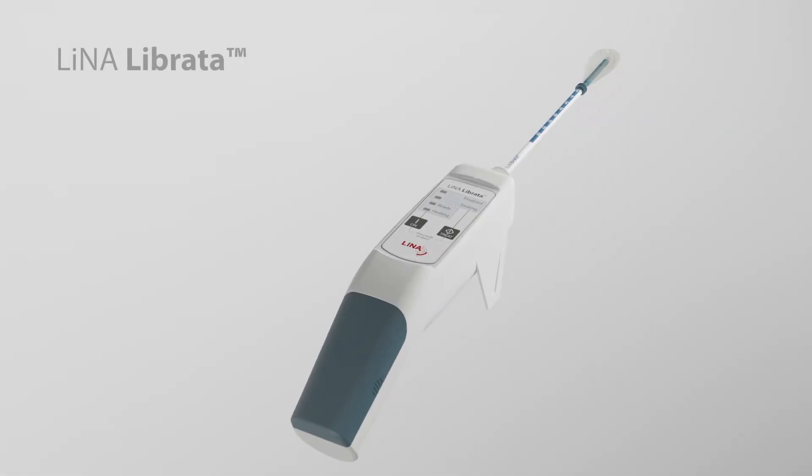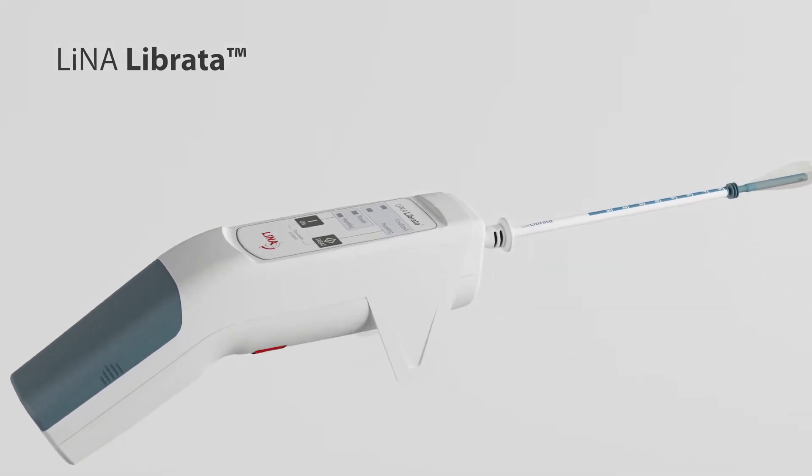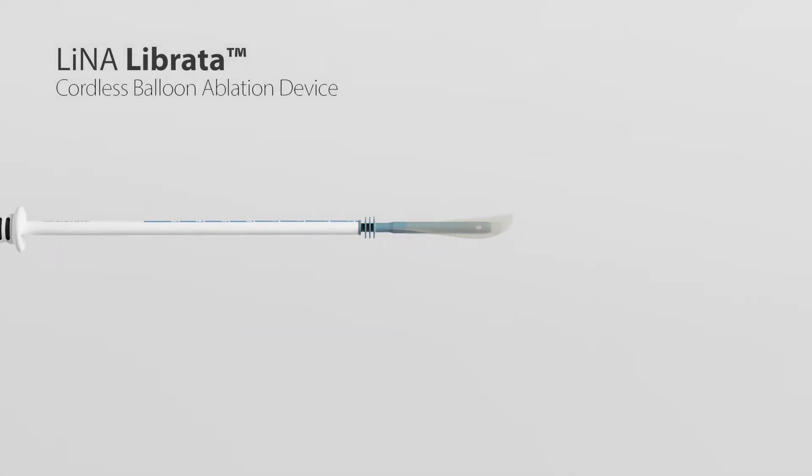Introducing Lina Librata — the first ever fully automated disposable cordless ablation device, utilizing balloon technology with an approximate two-minute thermal treatment time.